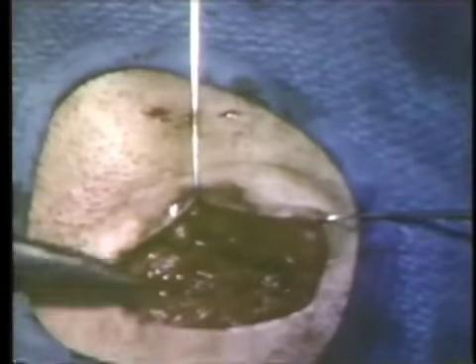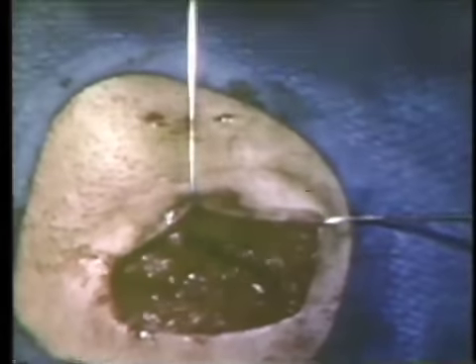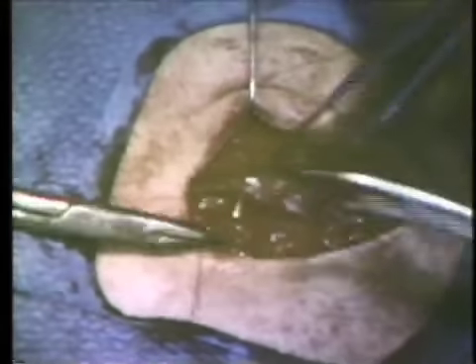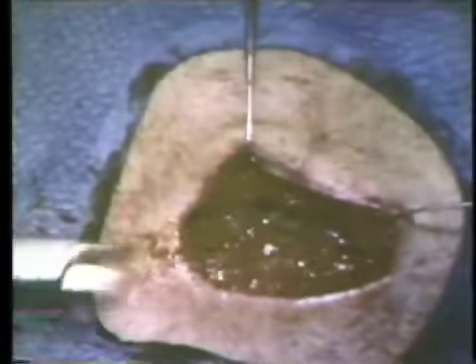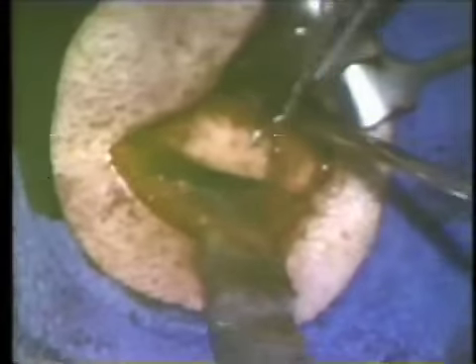The requirements of repair are quite similar. A little more extensive here in this drill cut than with a traumatic fracture, in which there is less disturbance to the bone margins in most instances. The closure here is fairly routine.